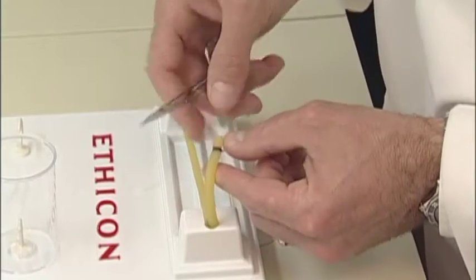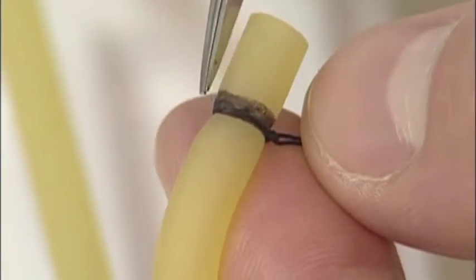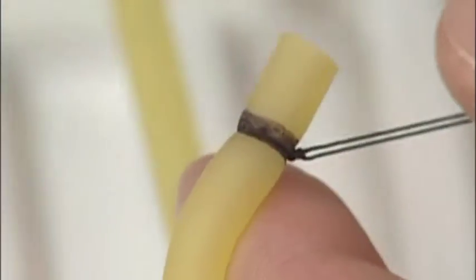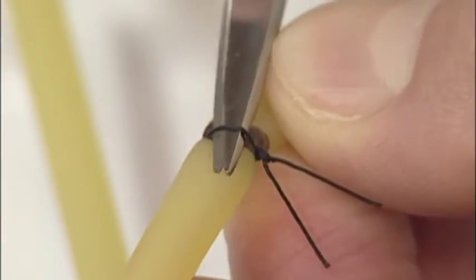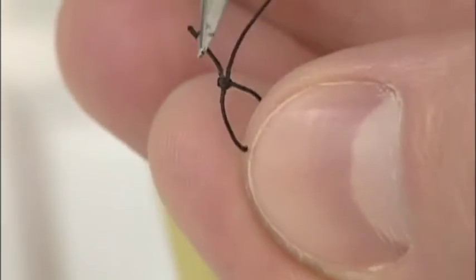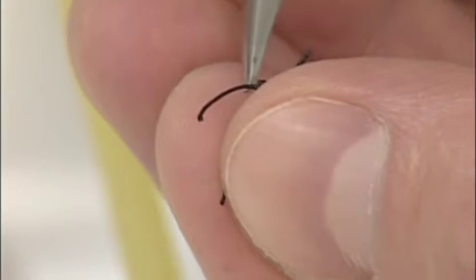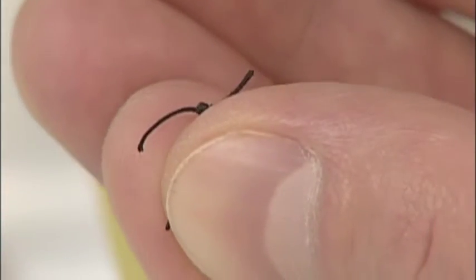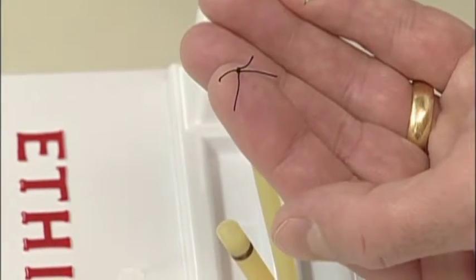We also assess any gap type of error, and there is really no gap as the ligature was squeezed down very tight on the rubber tubing and in fact indents it. We can cut our tails to a short distance as shown here, and then we can slide these relatively pointy scissors underneath and assess for knot security errors. And as you can see, the 2 tails that I cut remained equidistant from the knot and remained intact, and the suture strand itself broke, indicating that we have a secure knot with no penalties assessed.